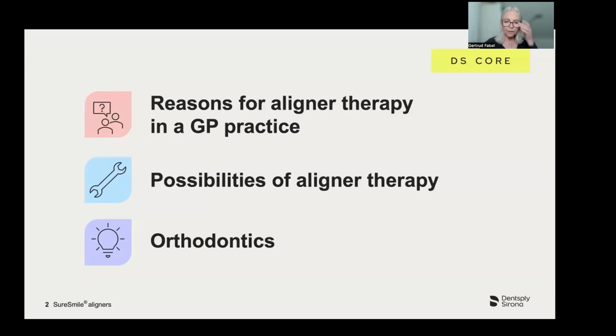Crowding in the lower front teeth often leads to severe wear, discoloration, or frequent loss of fillings in the upper incisors. Before considering veneers or crowns, aligning the lower incisors can help improve and preserve antagonistic tooth material, and in many cases, a minimally invasive or non-invasive treatment is sufficient.